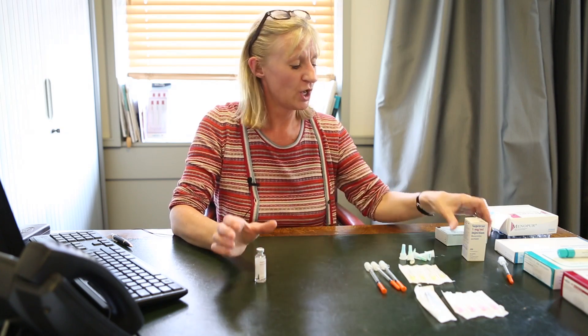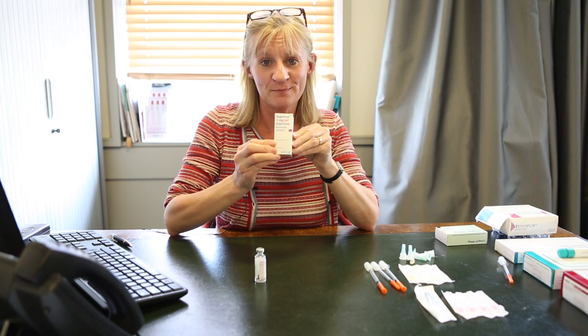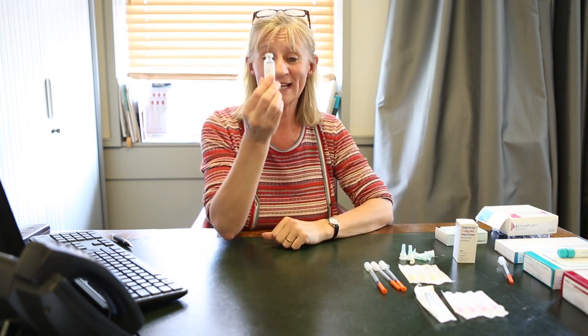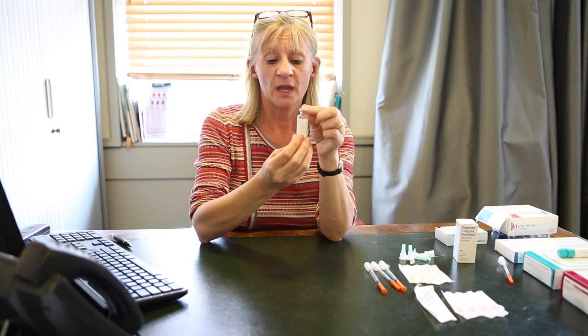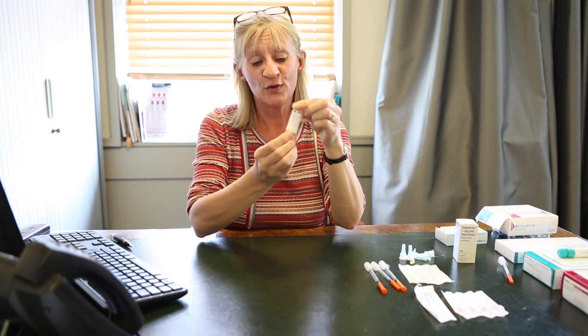The first drug I'm going to show you how to inject is something called Buserelin. It's actually called Suprecur, I know, but we always refer to it as Buserelin. Your Buserelin will come in a box like this, you take it out the box and it looks like this. It is a fluid — there are 5.5 mils in this bottle and mine, as you can see, has been used.